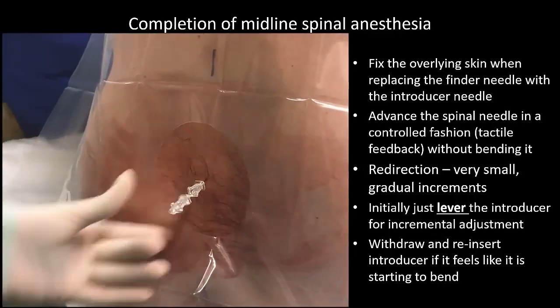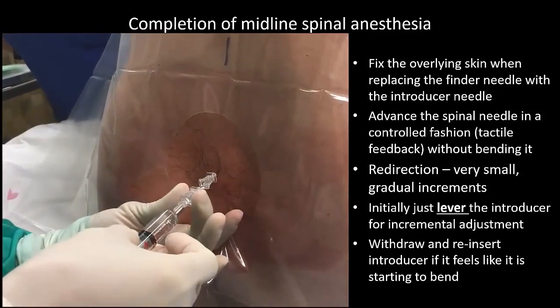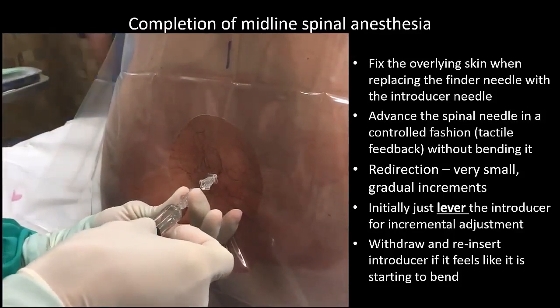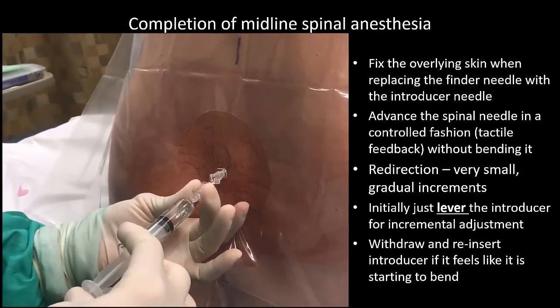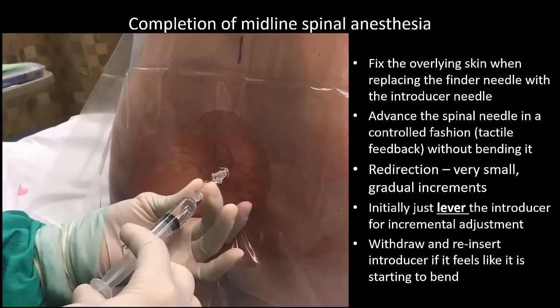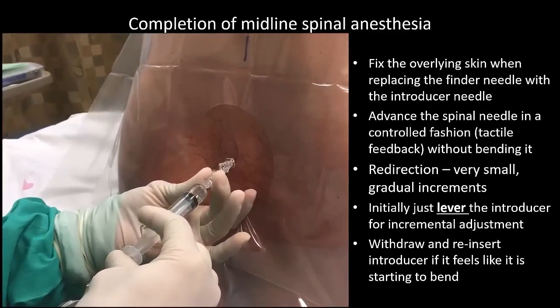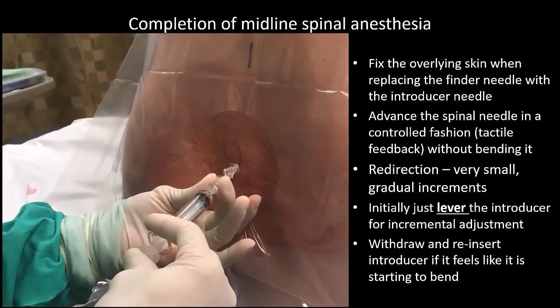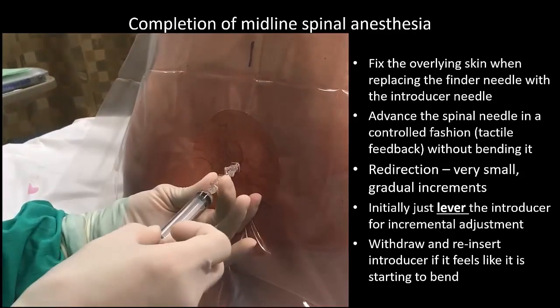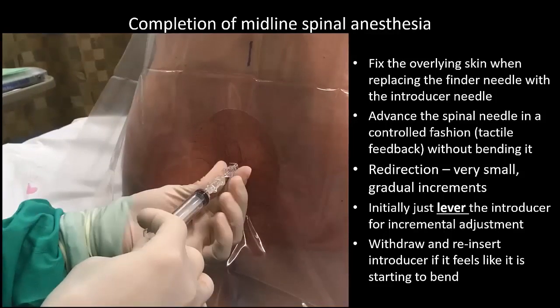Once CSF backflow is obtained, I attach the syringe with a gentle push and twist to get a good seal, and then aspirate very gently. My primary aim is not to dislodge the needle. I don't need to suck back 1 ml or even half a ml of CSF. I just need to sense that the plunger moves. Again, to minimize risk of dislodgement, I personally don't aspirate in the middle of injection. I aspirate gently at the end to confirm that the needle is still in the space and that I have likely delivered all of the dose into the intrathecal space.